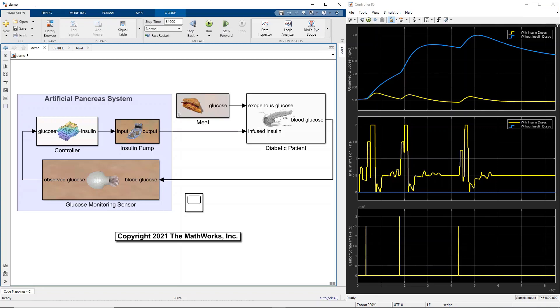Hi everyone, this video shows how to design a fuzzy inference system controller to regulate blood glucose of a type 1 diabetic patient using an artificial insulin infusion system.